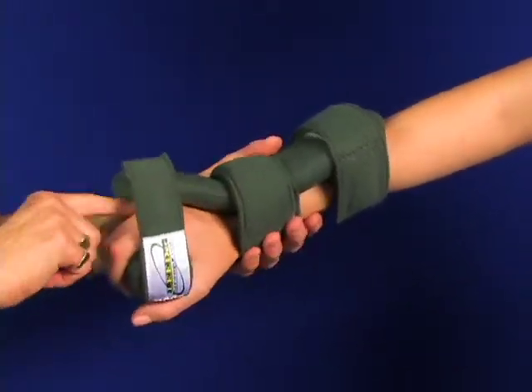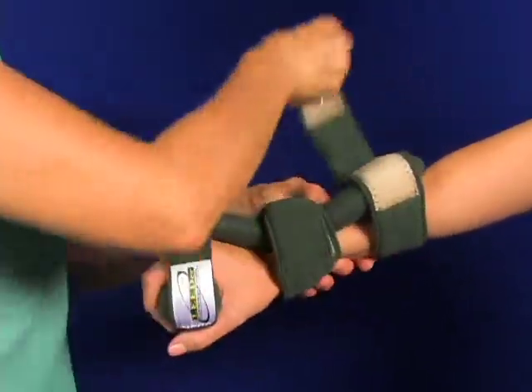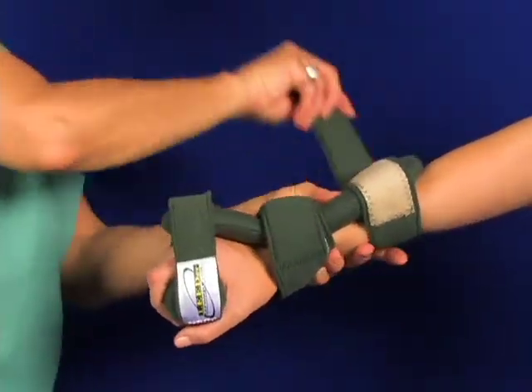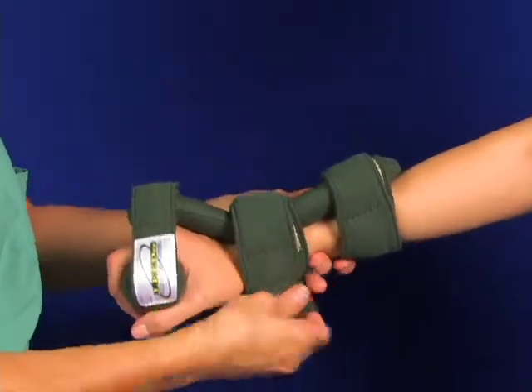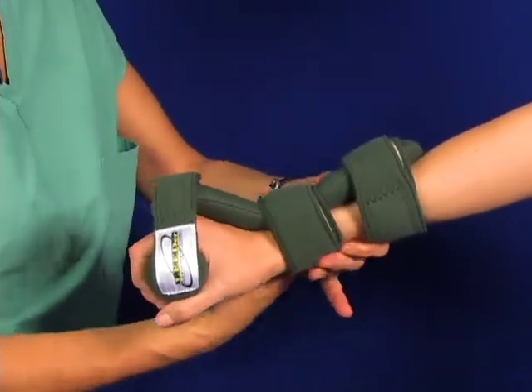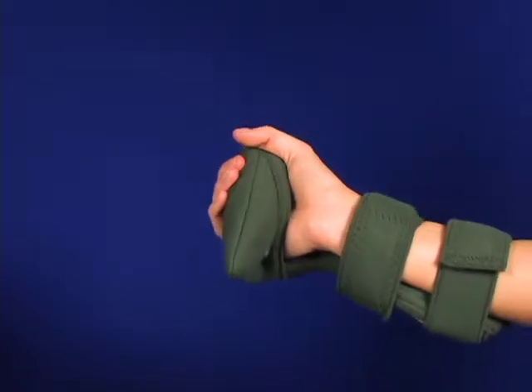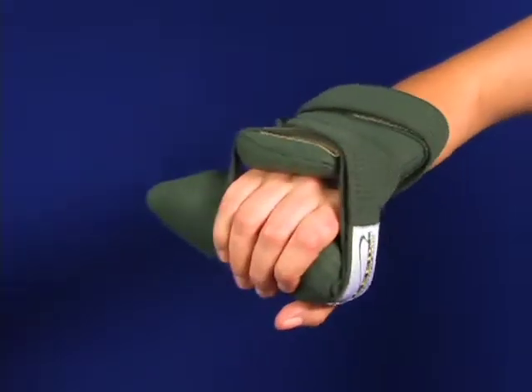Go back and check your tensions, readjust your straps as necessary, and straighten things up. You can bend that flexi core frame for just about any type of clinical situation — wrist drop, wrist extension. A lot of people just use that carrot to start to get people who are badly contracted really heading back in the right direction.